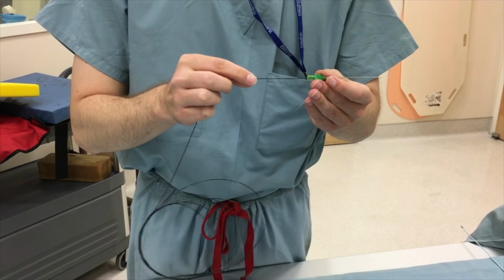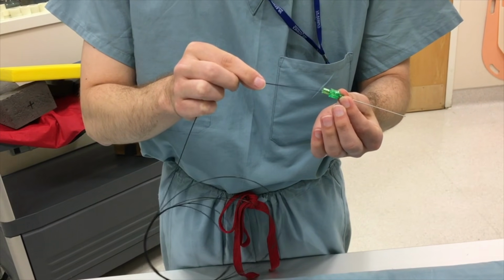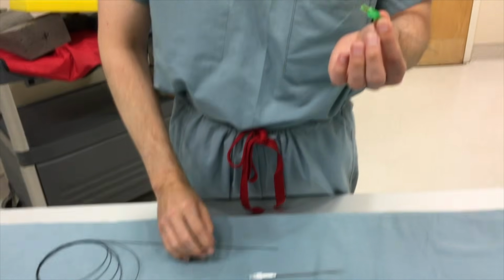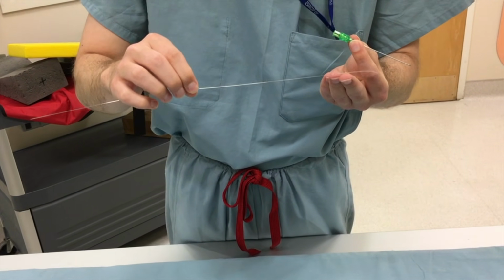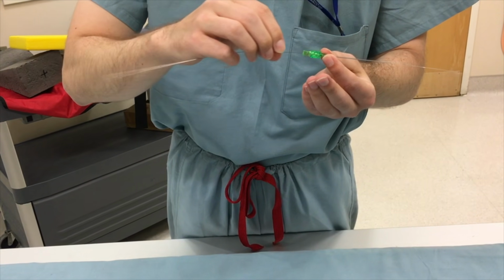it won't go in. So if you have access into the arterial system with this needle and you try to get this wire into the artery to do various interventions, it won't work, right? So what would you do in this case? So you have your arterial access here. You take a 0.018 inch wire. That can go through a 21 gauge needle. So you get that through.